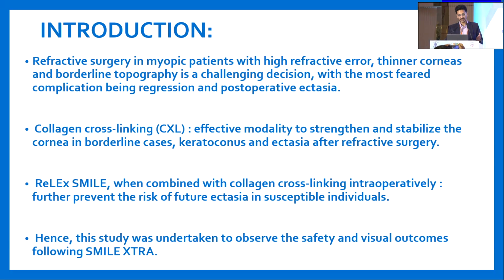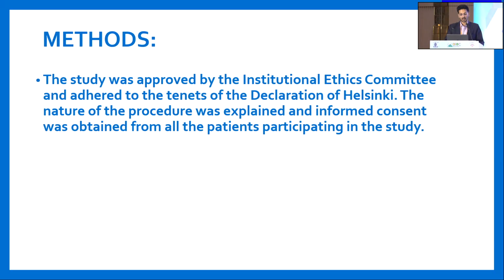Collagen cross-linking is an effective modality to strengthen and stabilize the cornea in borderline cases, keratoconus and ectasia after refractive surgery. ReLEx SMILE, when combined with cross-linking intraoperatively, further prevents the risk of future ectasia in susceptible individuals. Hence, this study was undertaken to observe the safety and efficacy of visual outcomes following SMILE Extra. It was approved by the Institutional Ethics Committee and adhered to the tenets.